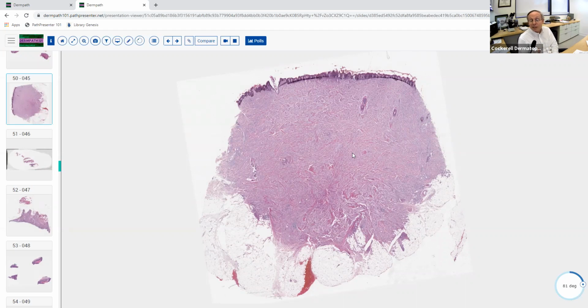They did have a CMV on the exam and some other things. So they have a mixture of pretty easy stuff and some stuff that's a little harder. So this would kind of fall into the little harder category. You have to be able to recognize what this is.